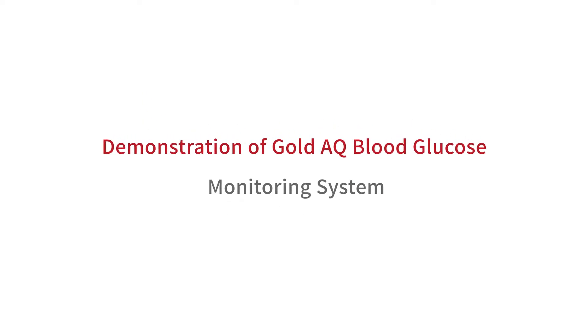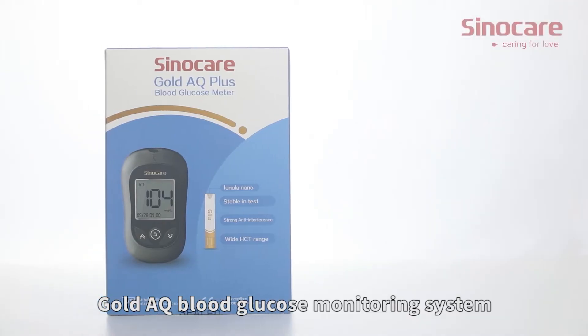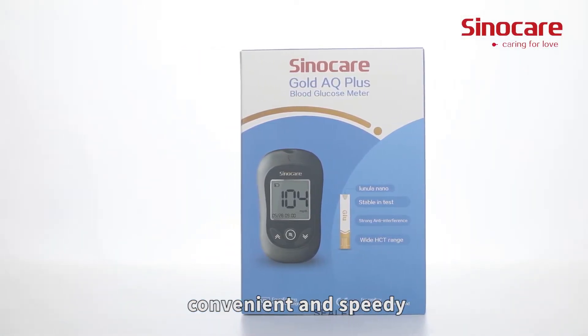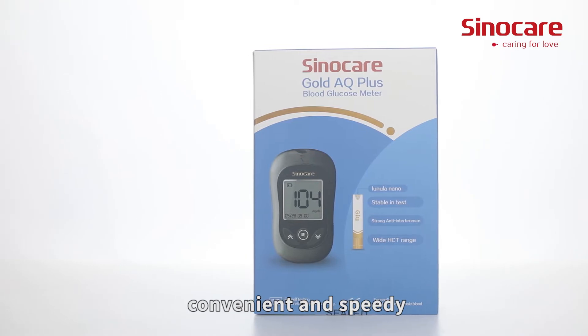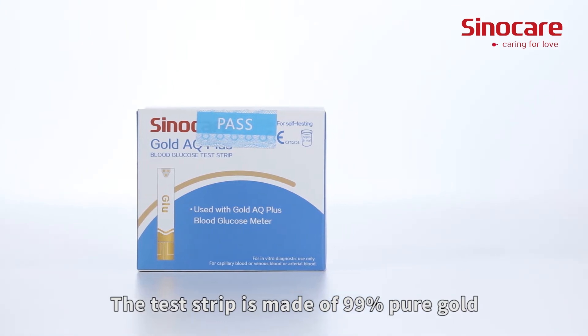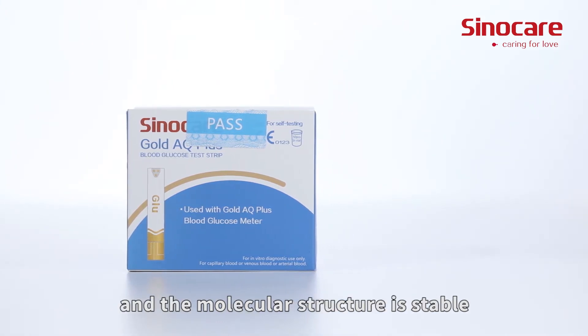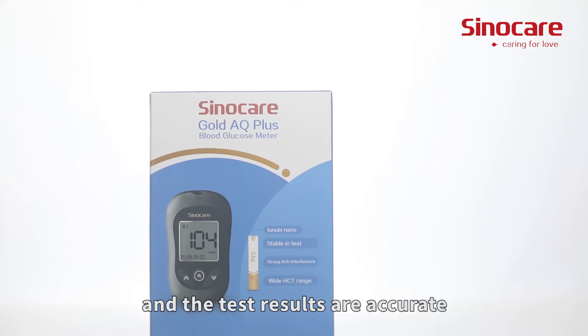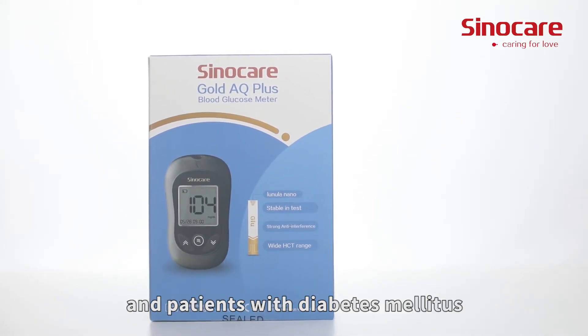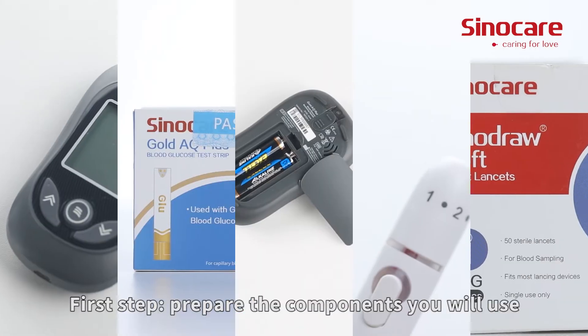Demonstration of the Gold AQ Blood Glucose Monitoring System. The Gold AQ Blood Glucose Monitoring System is easy to operate, convenient, and speedy. The test strip is made of 99% pure gold, and the molecular structure is stable, so the test results are accurate. It can be applied to medical organizations and patients with diabetes mellitus.